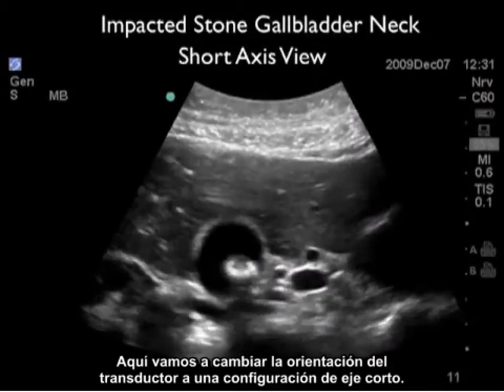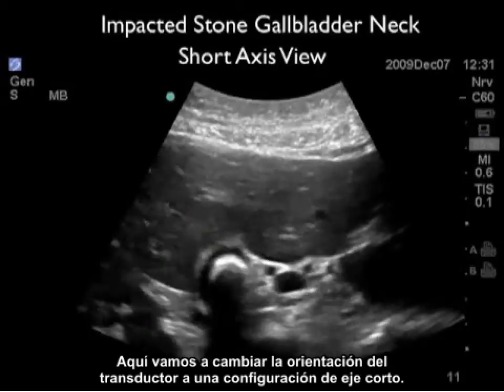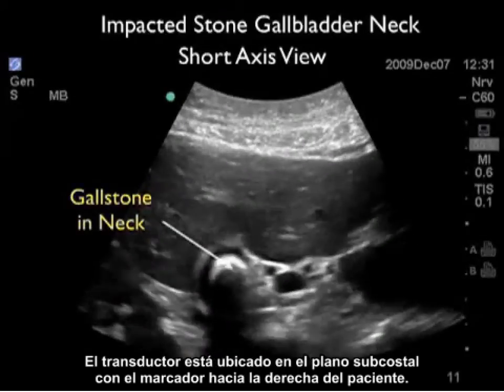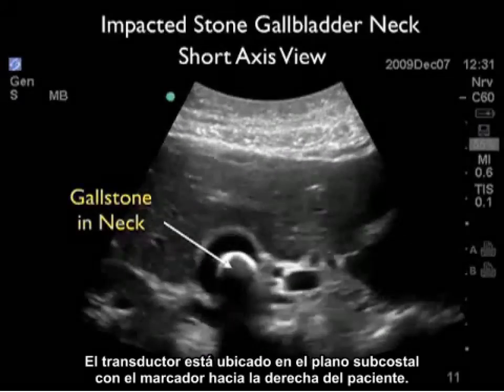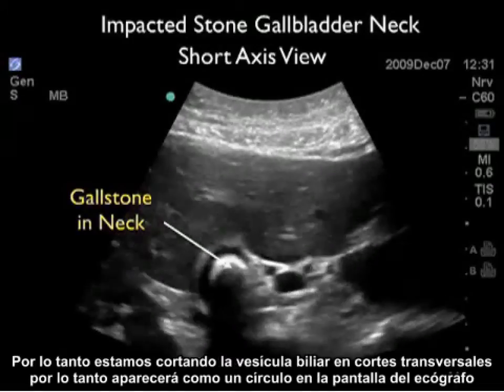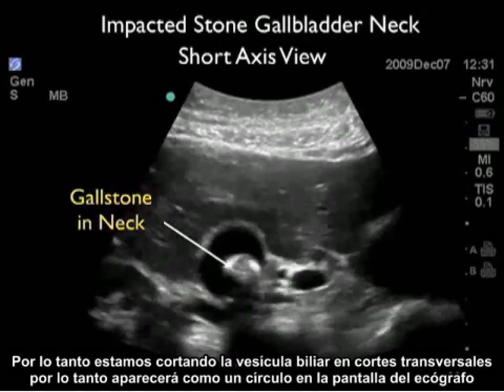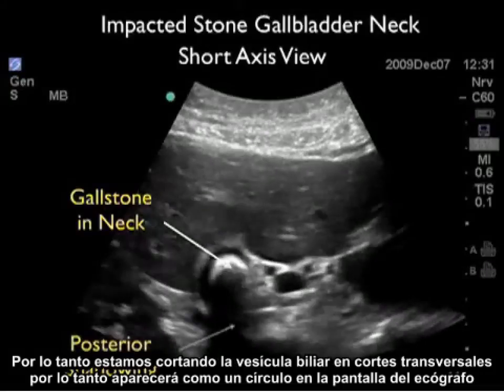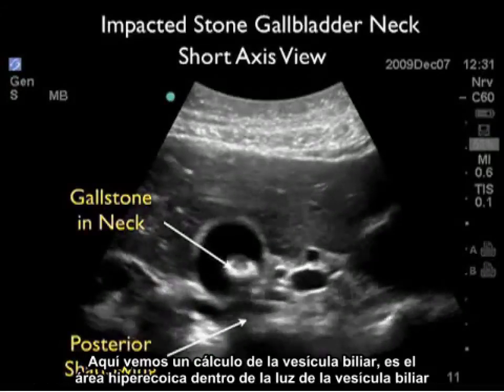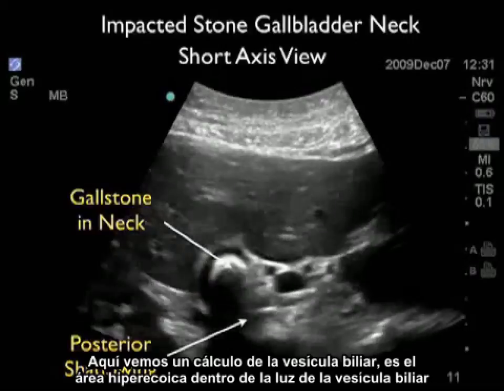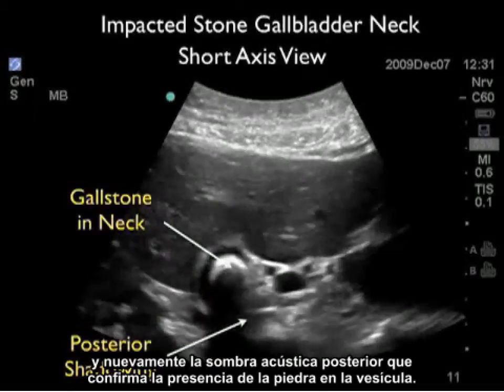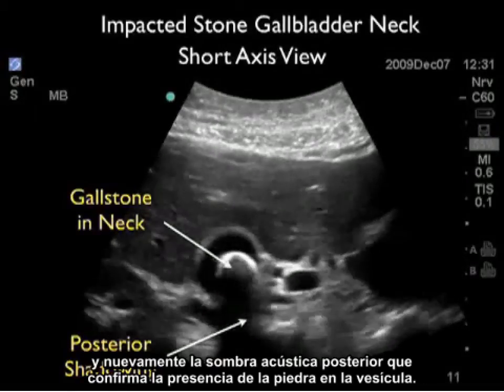Here we change the orientation of the probe into a short axis configuration. The probe is in the subcostal plane with the marker towards the patient's right, cutting the gallbladder into cross sections so it appears as a circle on the ultrasound screen. We see a gallstone — that hyperechoic area within the gallbladder lumen — and again the posterior acoustic shadowing, confirming the presence of a gallstone.